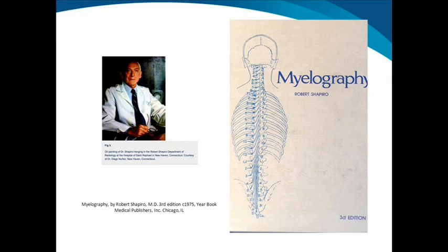Myelography is a relatively tried and true procedure. Among many practitioners in community hospitals, they feel that it may not be required anymore, that it's been supplanted by magnetic resonance imaging, MRI, of the lumbar spine. But in fact, there are several specific scenarios where myelography is important for troubleshooting the cause of lower back pain and radiculopathy, and I'll review the indications for that.